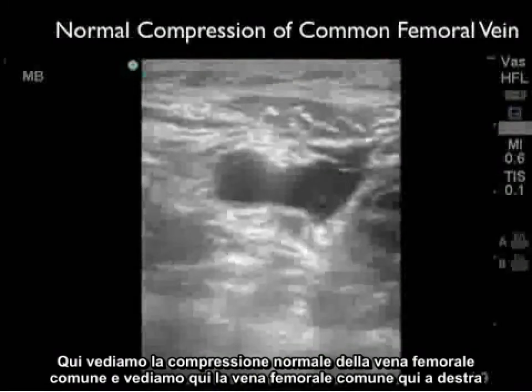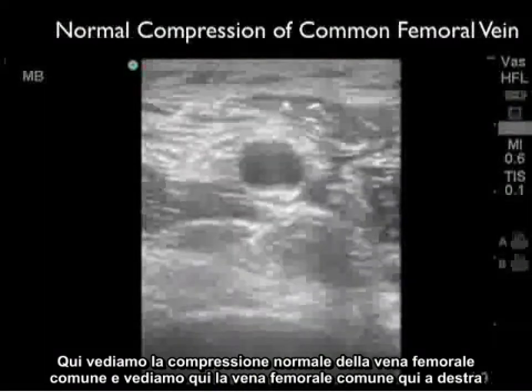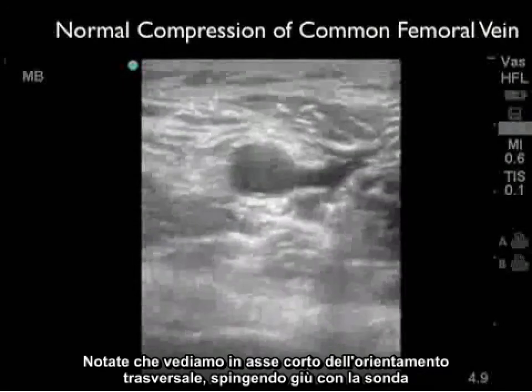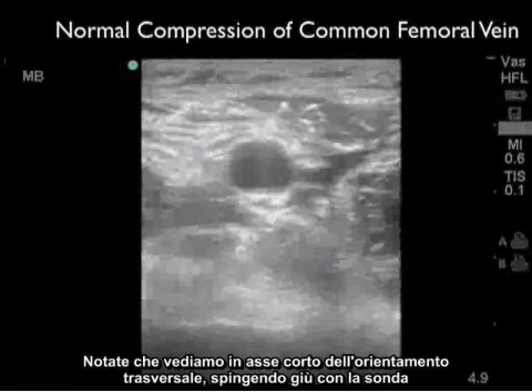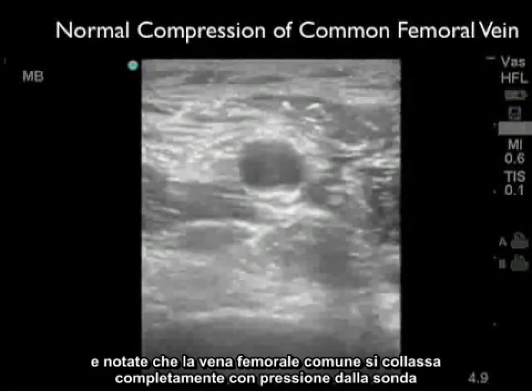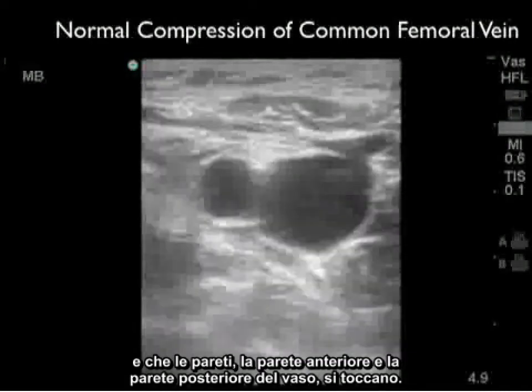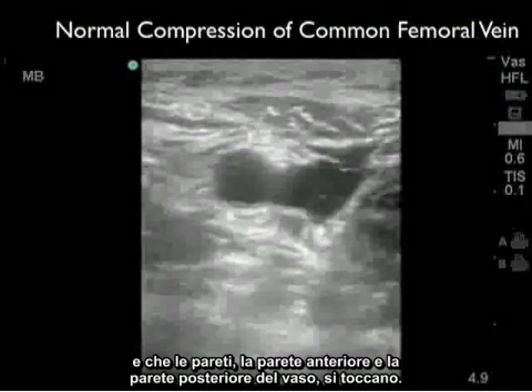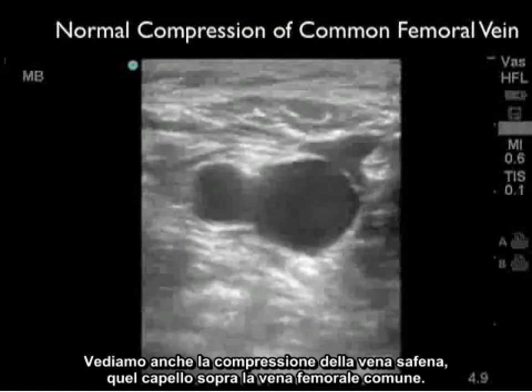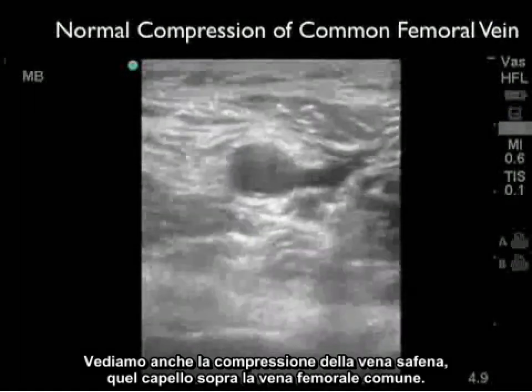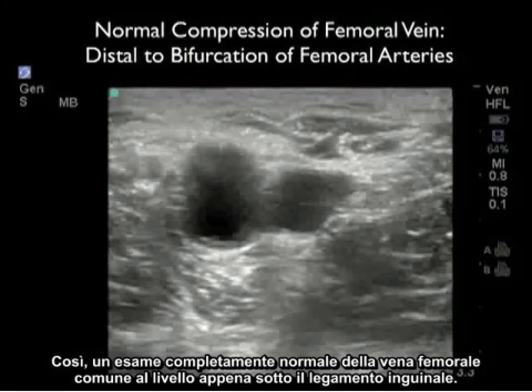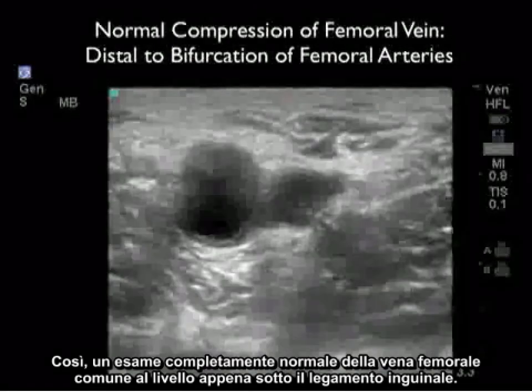Here we see normal compression of the common femoral vein, seen to the right of the common femoral artery which we see to the left. Looking in the short axis or transverse orientation and pressing down with the probe, the common femoral vein completely collapses and the anterior wall and posterior wall of the vessel meet. We also see compression of the saphenous vein — that little cap on the top of the common femoral vein — a completely normal exam at the level just below the inguinal ligament.